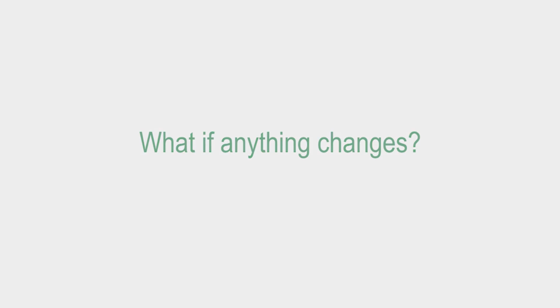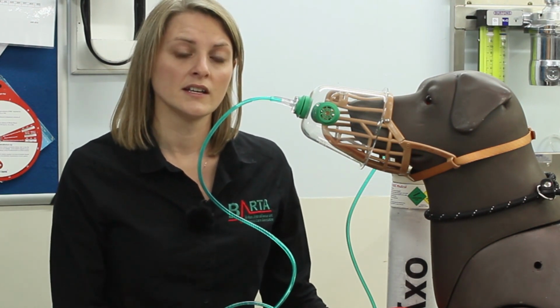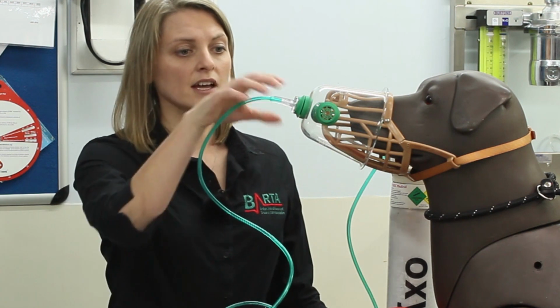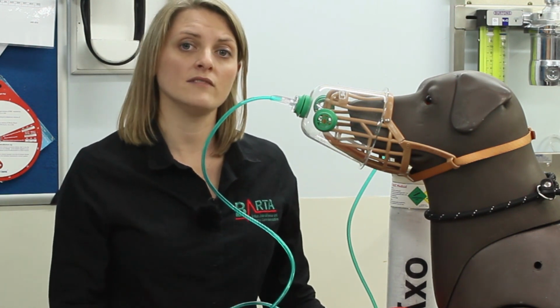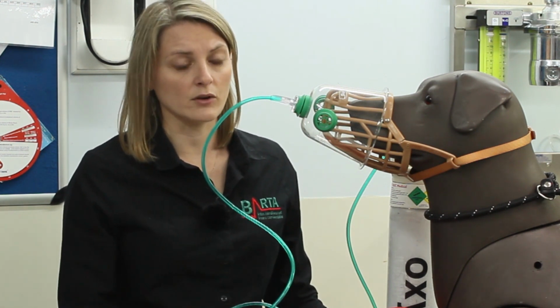As this animal goes forwards and it's recovering, hopefully with the oxygen on board, you might find that as they regain consciousness or as time goes by and they start to feel better, they may become less tolerant of the oxygen therapy, and you may then wish to either remove the mask and use flow-by, or you can try initially turning the flow rate down from 5 to 2 litres per minute and seeing if that's enough to allow the animal to settle. Also, just being aware they may feel quite disorientated and scared, and just using nice calming voices or getting the owner nearby to help reassure that animal can help significantly improve the outcome for these animals.